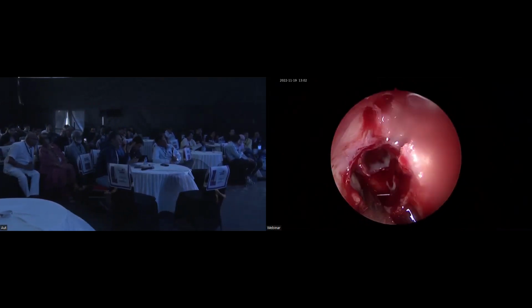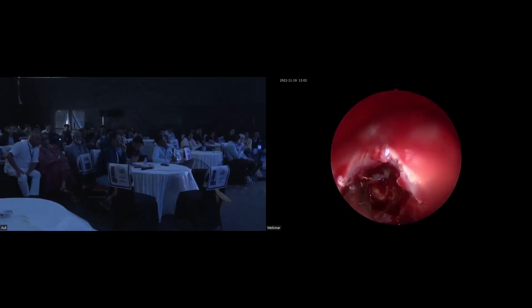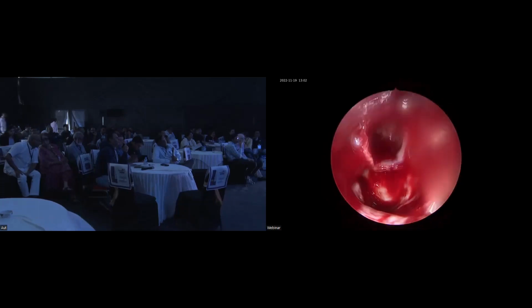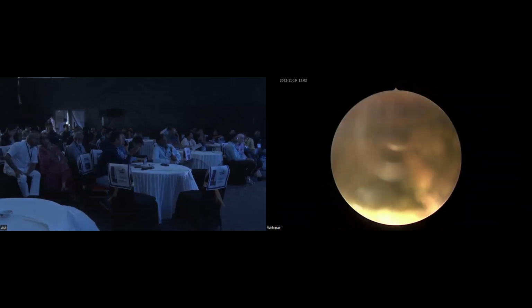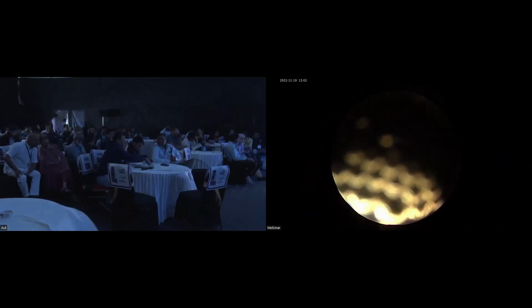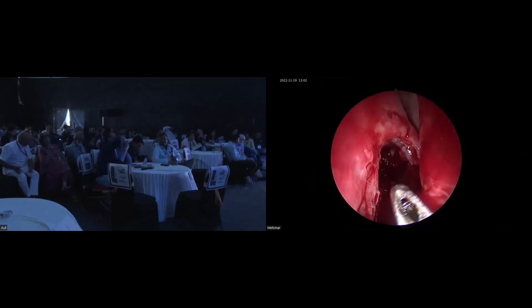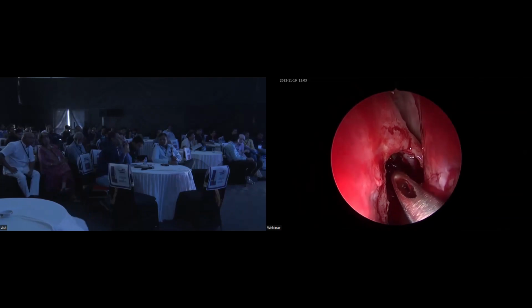Upper forceps, baby upper now. Very small upward is there. Please give me my forceps. Yeah, that's the frontal sinus only. Yeah. So give me a Merocel with adrenaline, pure adrenaline.